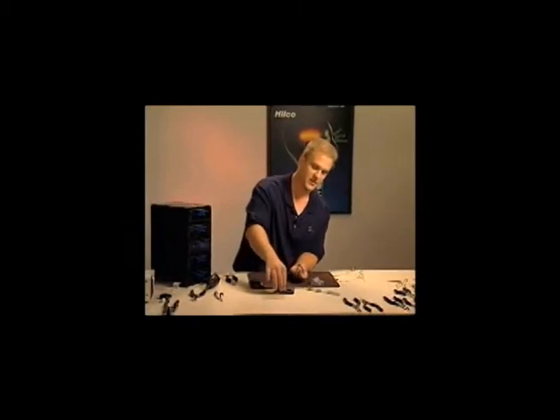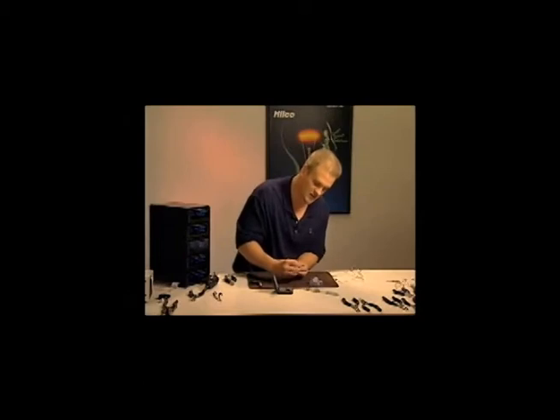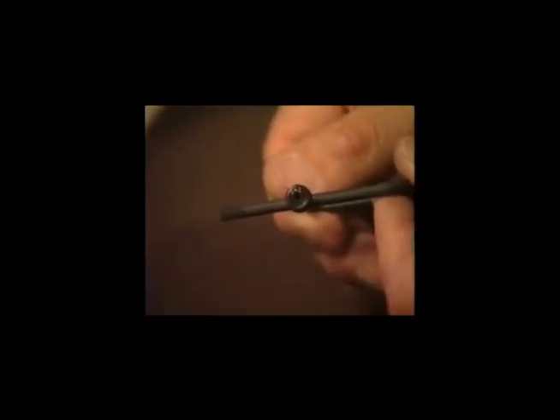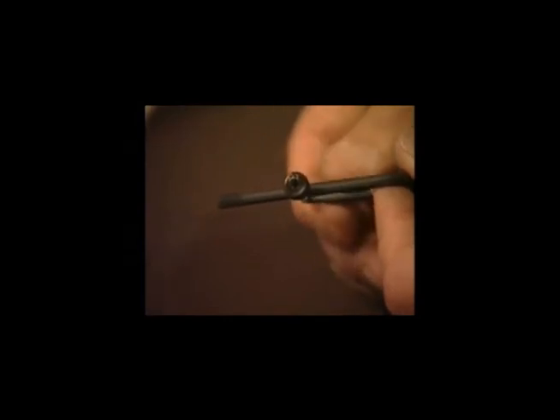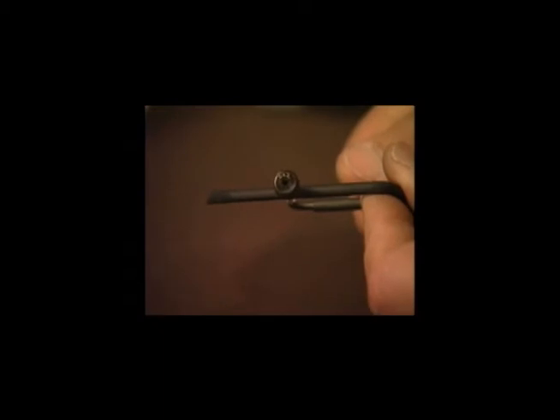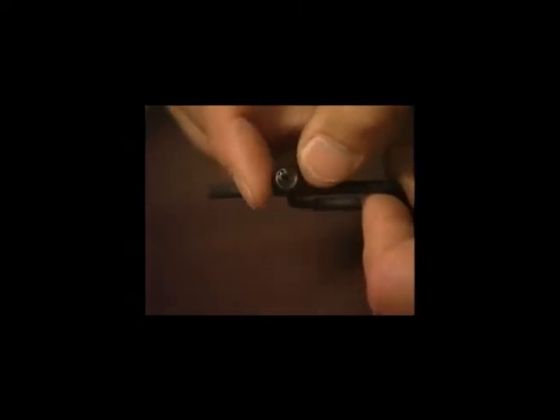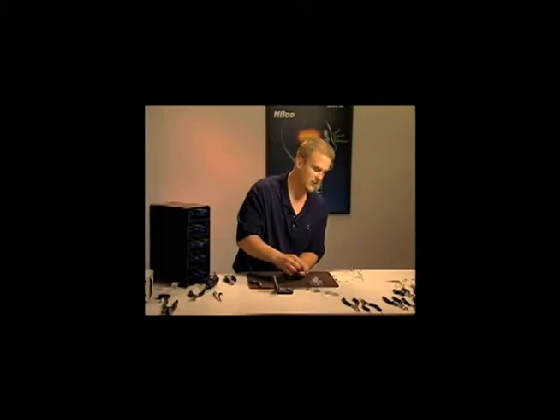The kit comes complete with the drill bits that you need, so you don't have to worry about the drill bit size. You'll have some to start out with. There's also a laser etching on the top of the guide, 0.043. That is the drill bit size that is used with this guide. That happens to be very close to 1.4, which is probably the most popular screw in the industry, and it'll knock out anything from a 1.3 to a 1.6 screw with no problem.